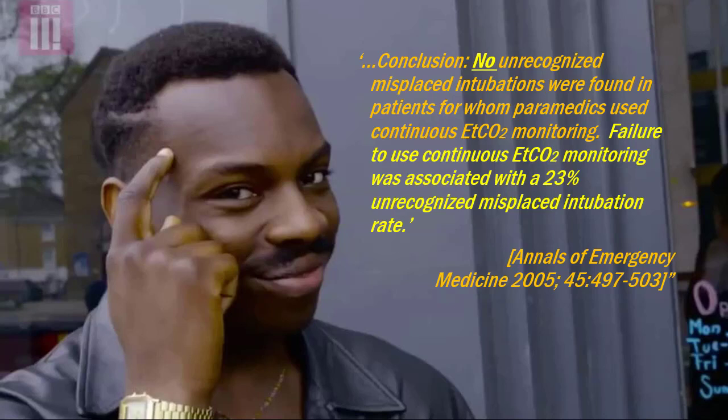Failure to use end-tidal CO2 monitoring was associated with a 23% misplaced intubation rate. 23%. Now at this time you think, man, those paramedics must really suck. Well, a 23% misplaced intubation rate roughly corresponds to about a 77% first pass success, which is about normal in many EMS systems.